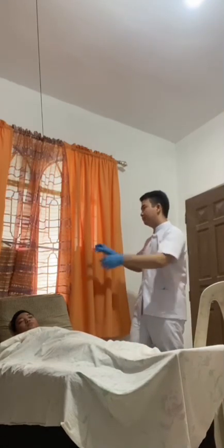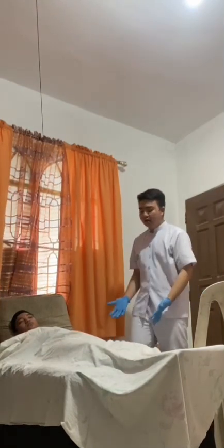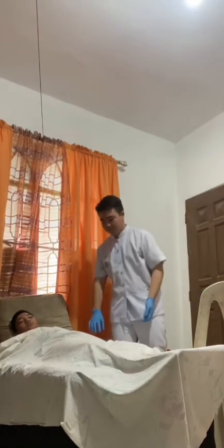And next, I am going to close the curtains for privacy. And I am going to remove the top linen of the patient.